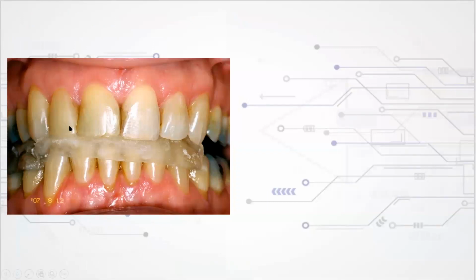This is a patient who had sleep apnea, and he was sent to me after the sleep apnea with this appliance, which was holding his vertical open for his airway and his jaw position. And the treating doctor wanted to couple his occlusion at that same vertical. So we use the appliance as a guide to prep the teeth and to design the occlusion. And that's why there's a piece of it missing here. I'm going to prep these teeth and provisionalize.